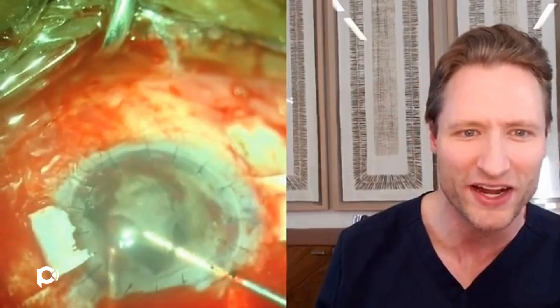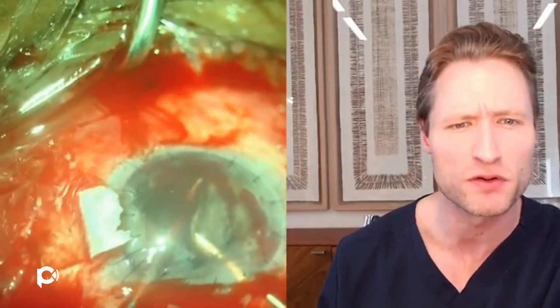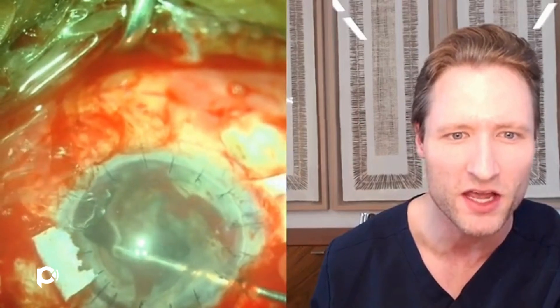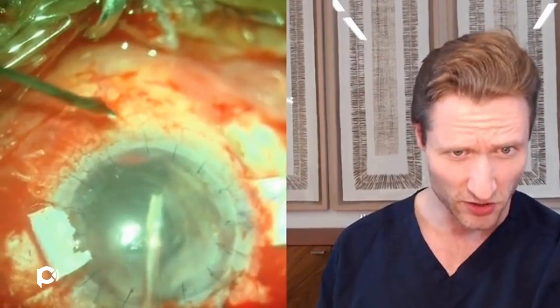You have to remove all of these materials so they don't fuse back up against the posterior corneal surface. What I'm doing is grabbing the iris and putting it under stretch with one hand, while the other hand uses coaxial curved retina scissors — 23-gauge — stretching and pulling the iris and cutting at the root, doing this 360 degrees around. This maneuver is easiest if the anterior chamber is filled with a dispersive viscoelastic, and if you take the iris piece by piece, making quadrants to cut off one piece then move along to another, rather than trying to strip it all in one piece. So we'll painstakingly and delicately remove pieces of the iris and this anterior lenticular membrane all the way around.